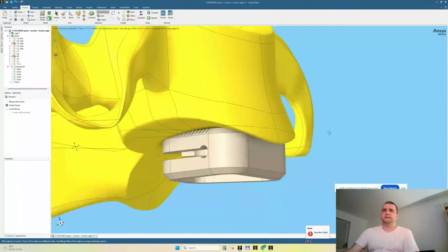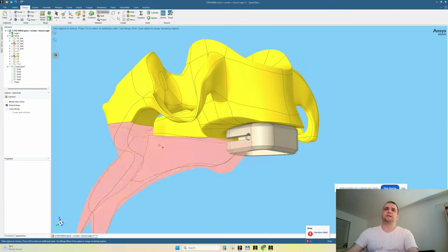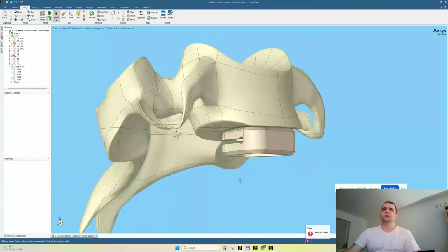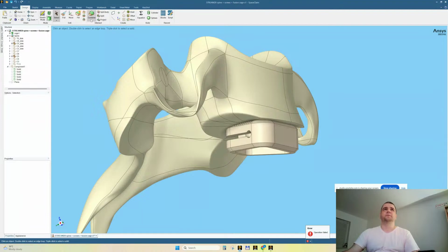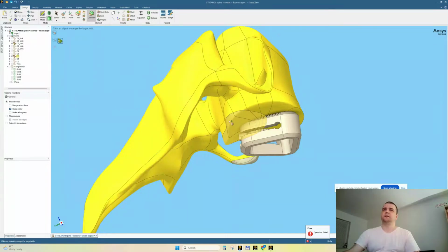So this is the part that I would like to remove. The problem is now it cut only also these ones. So let me re-merge them. Let me rejoin them together. Combine, click this part, and I can click here with plus. This will be joined to the original part. This, this, and this.